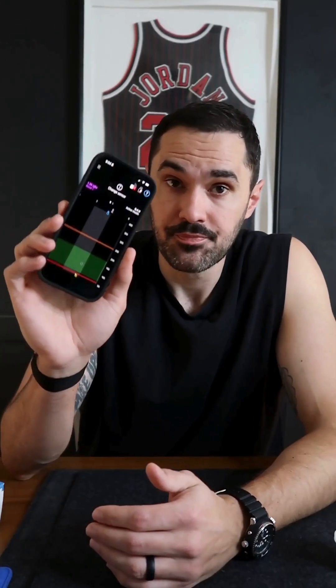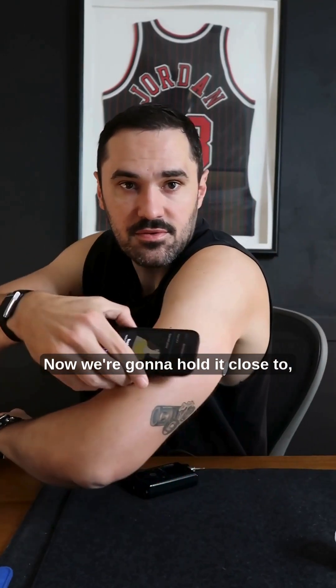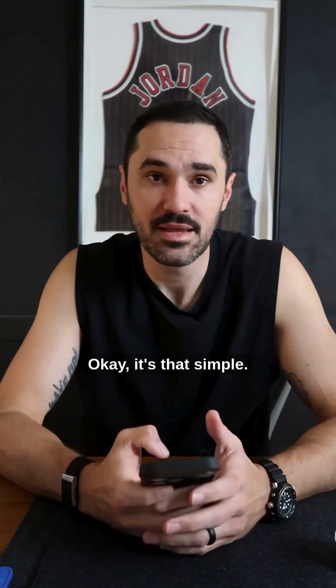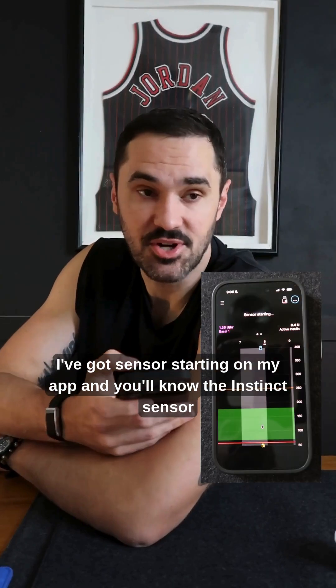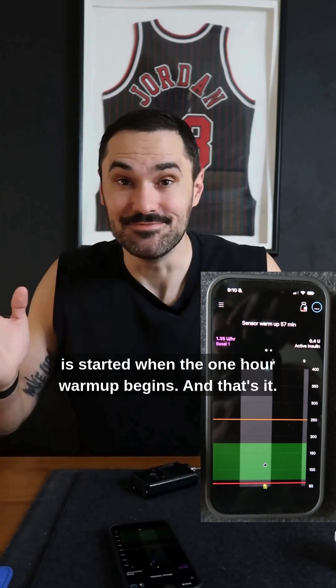Now we go to our MiniMed mobile app — scan new sensor. We're going to hold it close to... I heard it. It's that simple. My phone vibrated right away as soon as I scanned it over. I've got sensor starting on my app. You'll know the instinct sensor is started when the one hour warm up begins. And that's it.